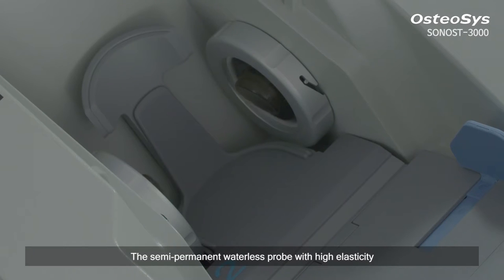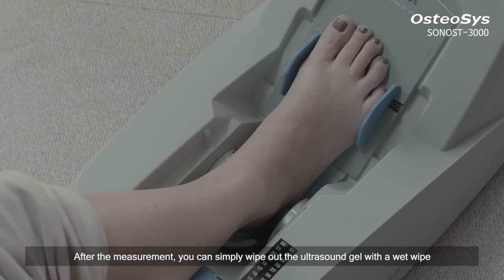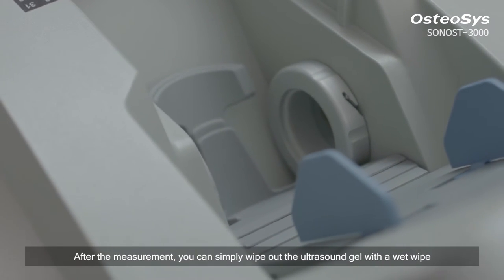This semi-permanent waterless probe with high elasticity makes you feel comfortable on your heel bones. After the measurement, you can simply wipe out the ultrasound gel with a wet wipe.